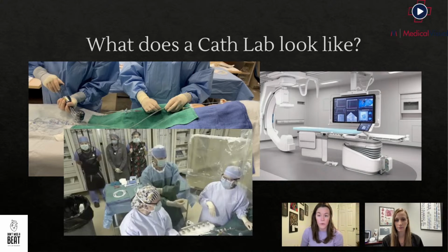the artery over and over again, with larger pieces of equipment, smaller pieces of equipment. We can get everywhere because everything in your body is connected, right? So the artery that I get in your wrist can go down to your toe, can go inside of your heart, up to your brain. So it's really amazing what we're able to do. What they are doing in that picture is inflating a small balloon that goes into the coronary artery as if someone was having a heart attack.